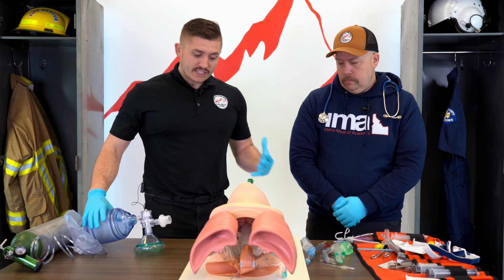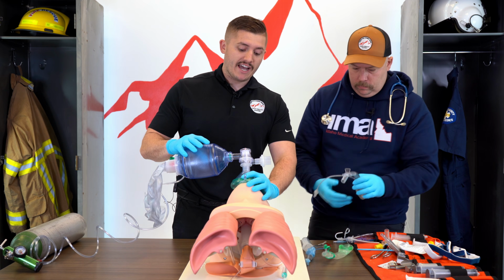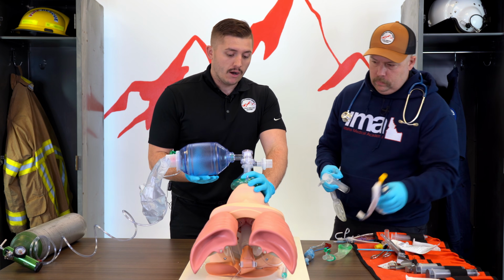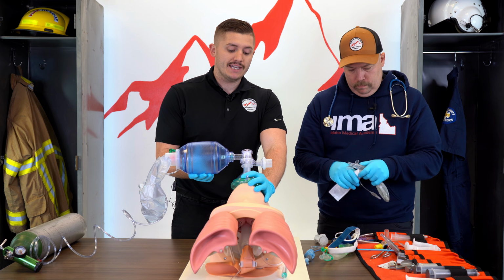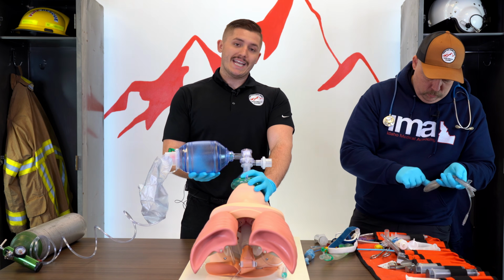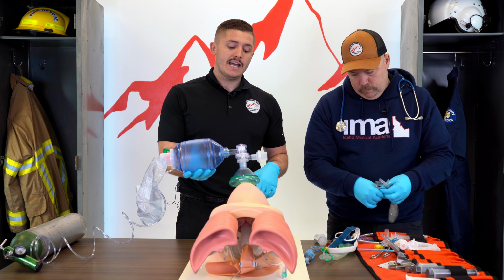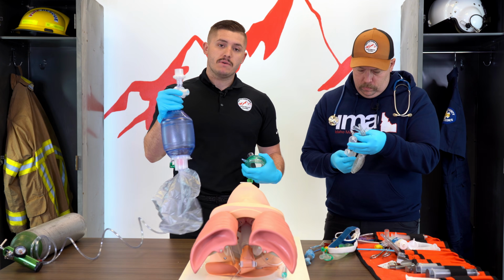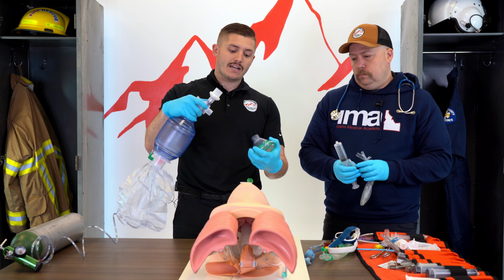So Chris here and I will demonstrate what this would look like on a call. If I'm the EMT basic, I have my NPA in, I have my OPA in, I'm bagging my patient. Once Chris is ready to place the airway adjunct, his LMA, inside the patient's oropharynx, he's going to let me know. And I'm going to take the BVM off, remove the OPA. I'm okay to leave my NPA. Then I'm going to remove the mask from my BVM. With this BVM, it's going to sit on top of the LMA, and that's how we're going to deliver breaths.